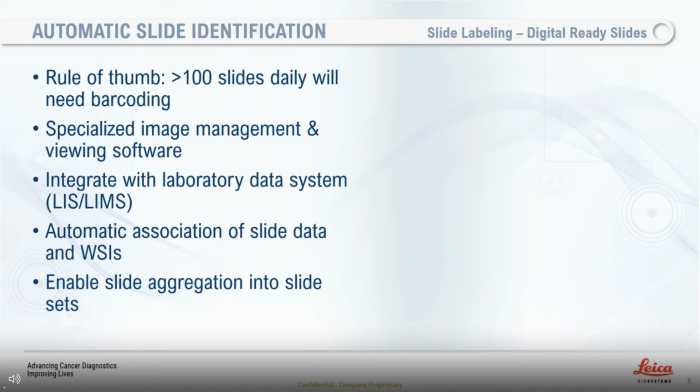And typically then you need to associate your metadata with those slides. So, where is that slide from? Which case or animal or study is it related to? And that's where integrating with your laboratory data system, whether that's your LIS or your LIMS, becomes absolutely integral into having an end-to-end solution for your digital pathology.